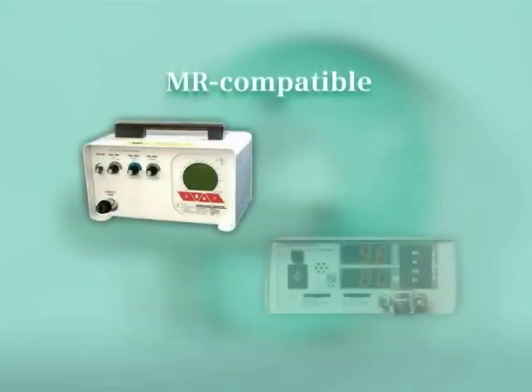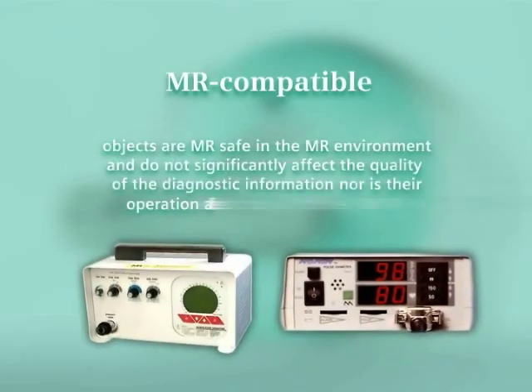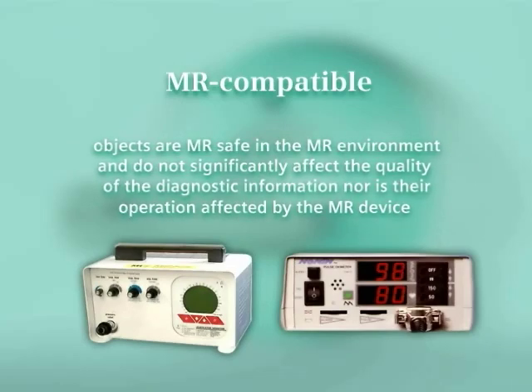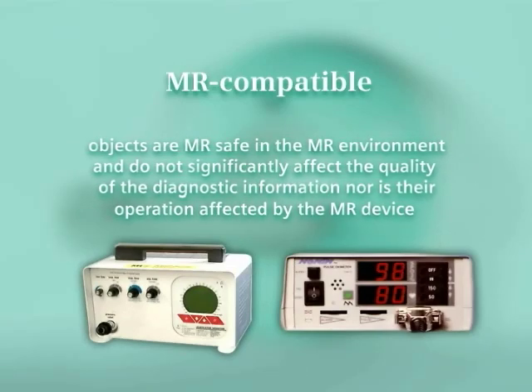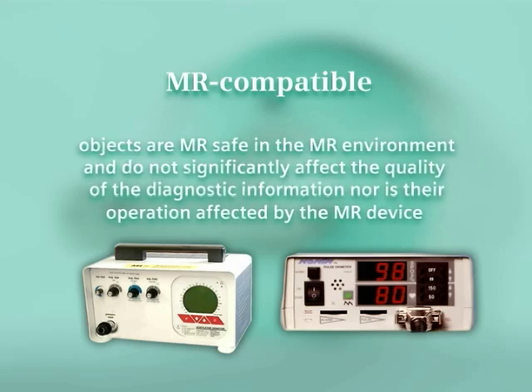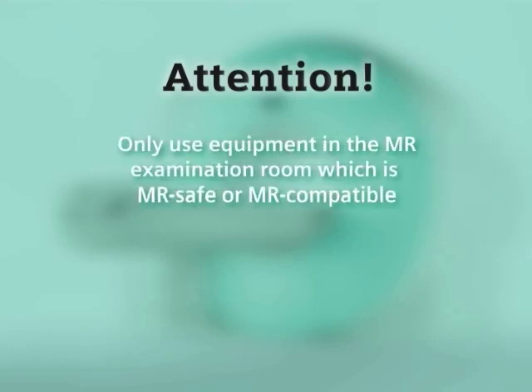These objects are MR compatible. This means they are MR safe in the MR environment and do not significantly affect the quality of the diagnostic information, nor is their operation affected by the MR device. They are specially labeled and can be used without consideration. Attention! Only use equipment in the MR examination room which is MR safe or MR compatible.